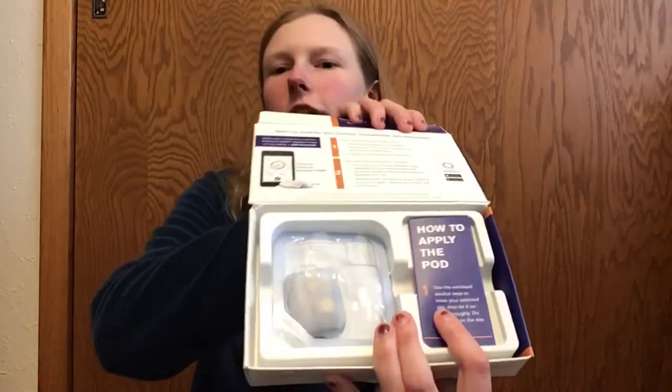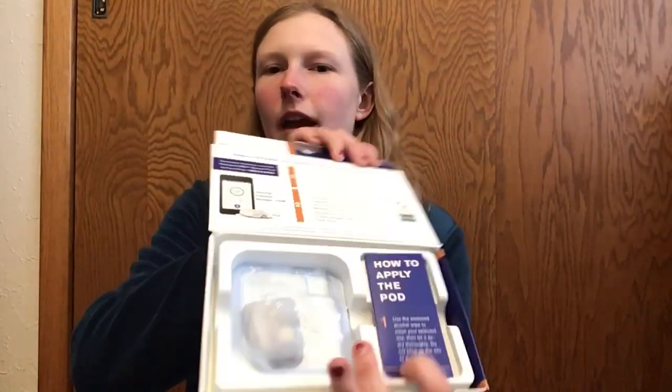I already called OmniPod, I have a quote from them, and I filled out their patient information form. I'm going to call them back on Wednesday to discuss a few more things, because I want to make sure I actually like this first and wear it for three days before I fully decide to go for it. If I don't like this, I'll probably stay on multiple daily injections until better insulin pumps come out. But I'm going to jump right into opening it up — inside they give you the demo pump and how to apply it.